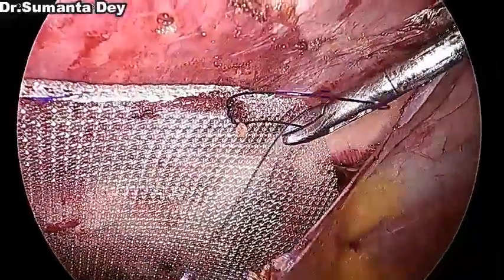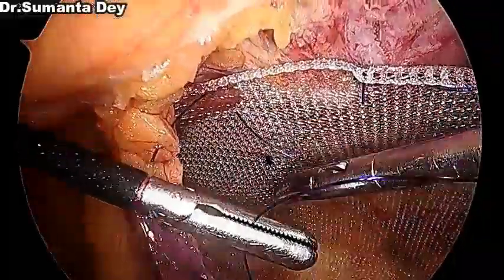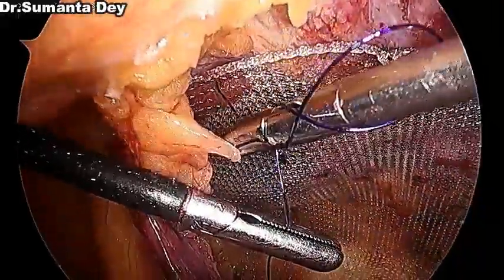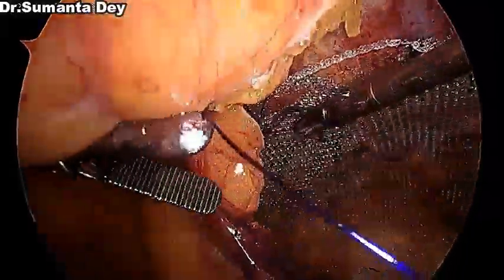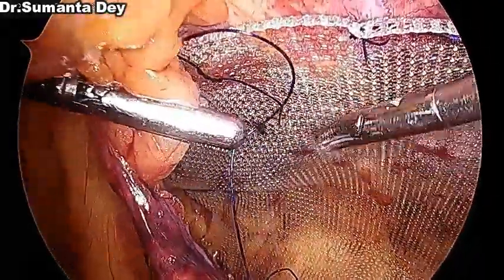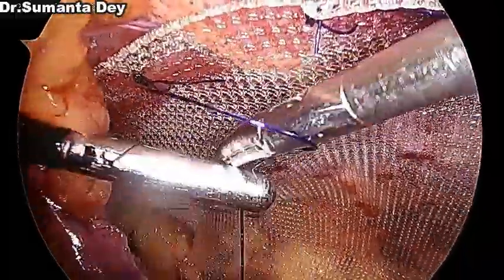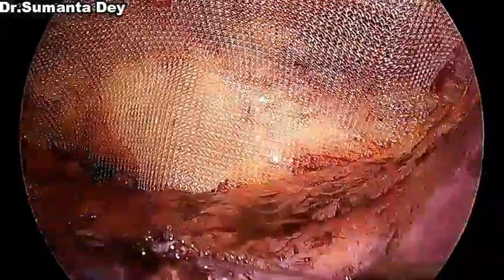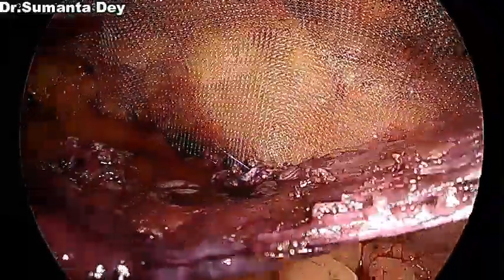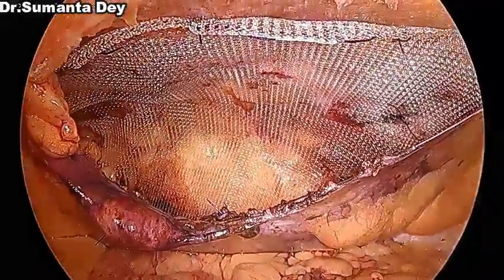Although it's a preperitoneal space, once you deflate the pneumoperitoneum, the mesh will sit on that area only, and there is very little chance of mesh migration or mesh crumpling. But as the area that I dissected is large, I decided to put a few stitches to keep the mesh intact over that area. That's it. I have fixated the mesh nicely, and you can see the mesh is sitting nicely without any folding, just to see whether the mesh is properly tucked and there is no undue folding over the lower part.